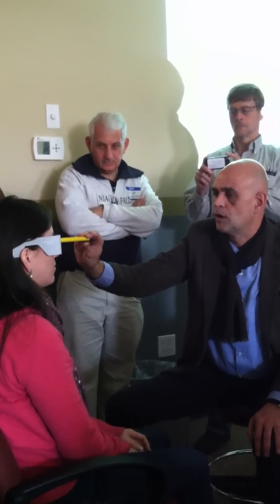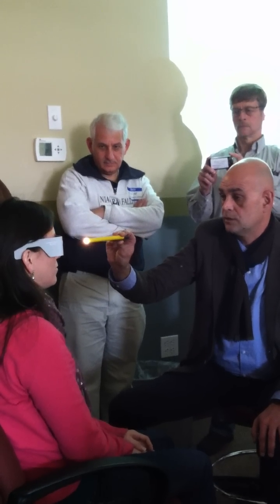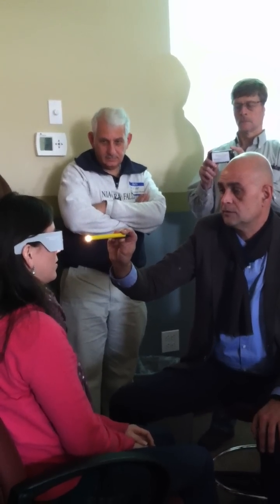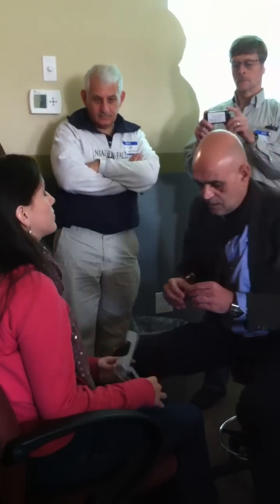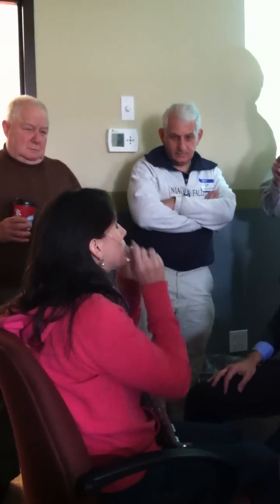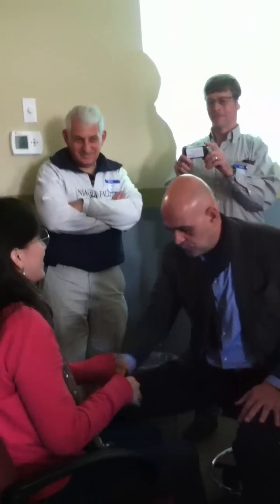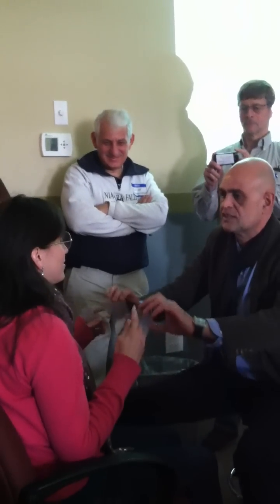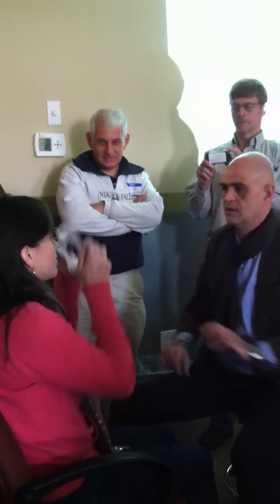You have one? Yes — confirming repeatedly. When you close your eyes, you take those glasses off. And here is another pair of goggles — with your eyes closed, you put it on. It's Harry Potter. And I'm Dumbledore. Here are two others, and you put them over there. Is it okay for you? Yes.